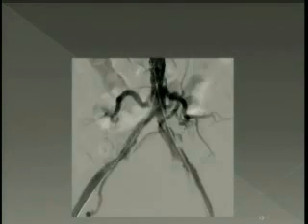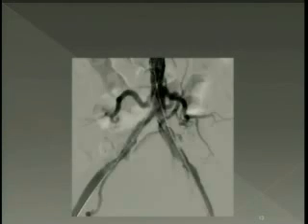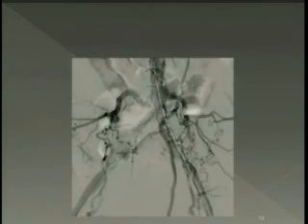If you go from the same side as we went in the beginning, you have more force because you have a very short segment to cover. You take, for example, a sidewinder or a type 1 or internal mammary catheter, and you can direct very slowly, and in at least 95% of the cases you reopen your artery. But it's not 100%. It's the same as for bibrachial or radial approach.